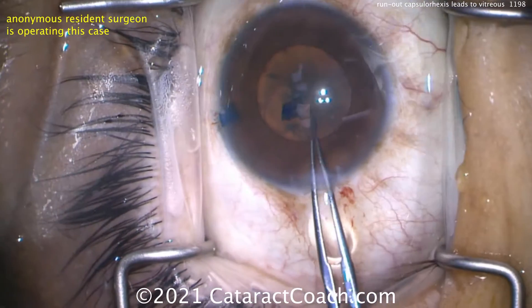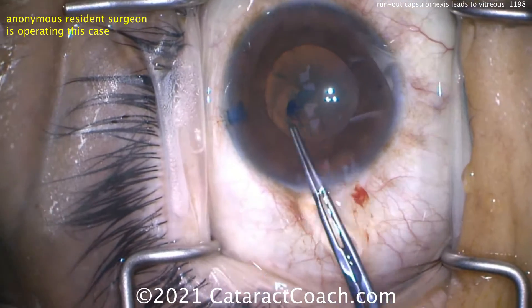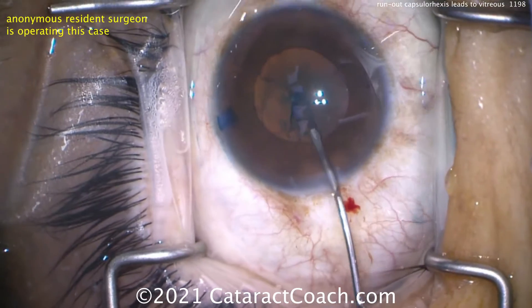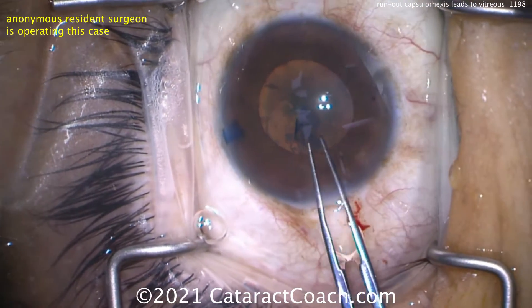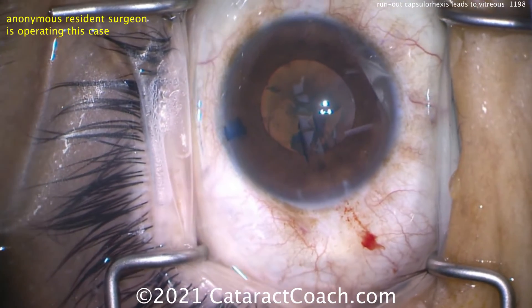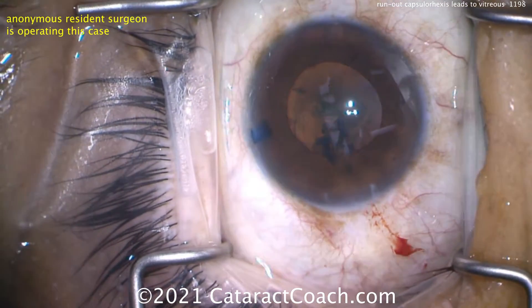Here in the sub-incisional space it's already run out, and you're not going to be able to continue. Trying the little maneuver, but it didn't work — it amputated. Now using a cystotome to nick the capsule and trying to continue, but remember we already have one area where the capsule has run out, so there's a weak spot there. Now continuing and switching over, starting the rhexis again.